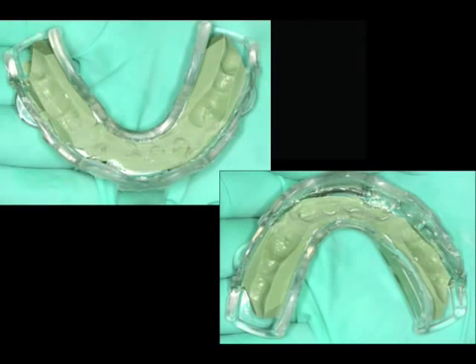As you see here, we have now trimmed the posterior area to where we have enough room for the borders, and in the anterior area, we only have the 4 little stops and there are no axial heights here. Now, why don't you want anything of the axial height? Because you may not be able to get it back in when you have other material if you have to go all the way back down this inclination.